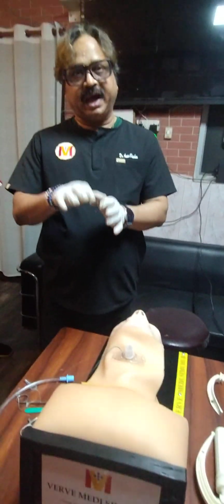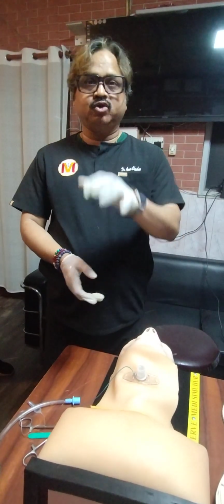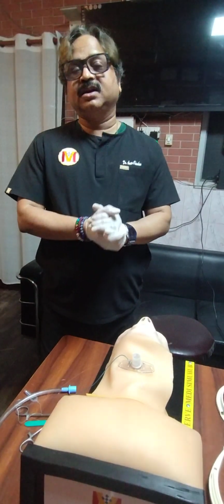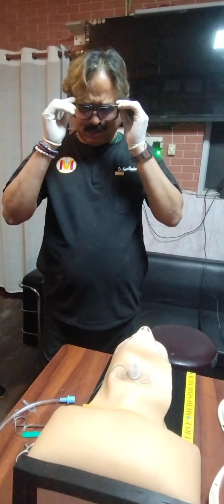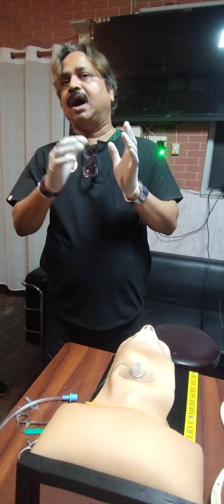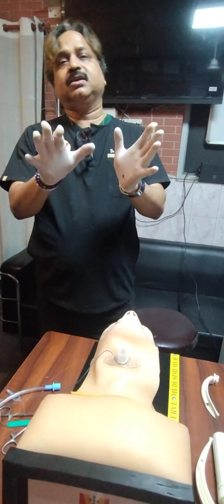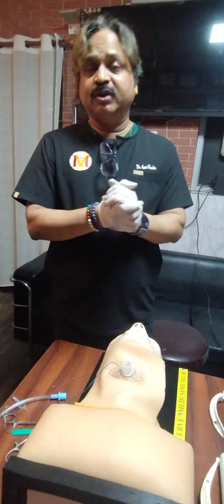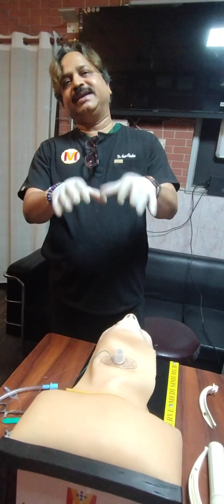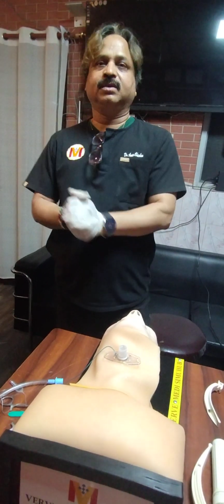Actually, we take too much time in deciding to do a surgical cric, but when you are intubating, then you can have an idea that this patient might need a surgical cric, and you should be mentally visualizing. You must take that decision, mentally simulating or mentally visualizing how you are going to do the procedure. And with this mannequin, I think these two scenarios are very good. So whenever you are holding a difficult airway workshop, please initiate the delegates with this mannequin so that they have the mindset that if they encounter these kind of scenarios, then they are going to follow those algorithms. Thank you very much.